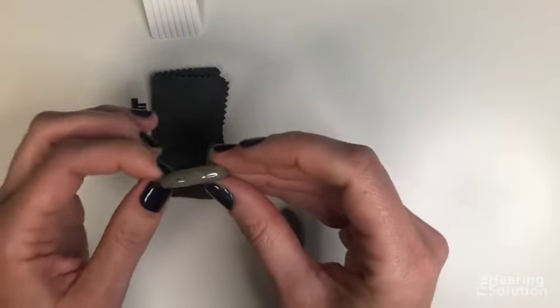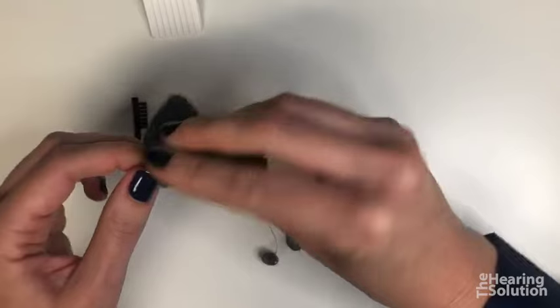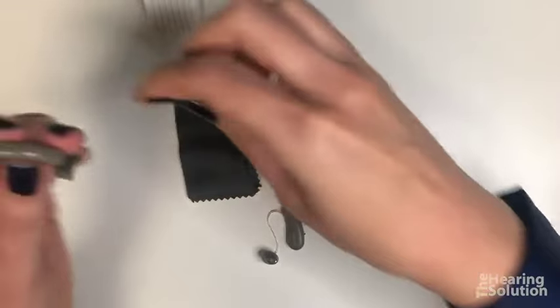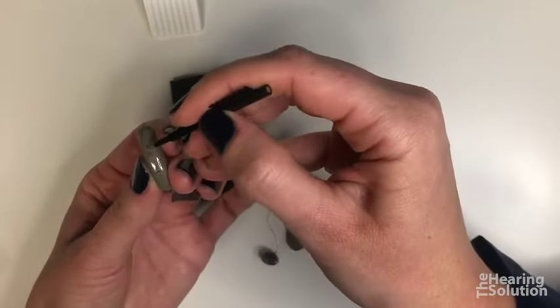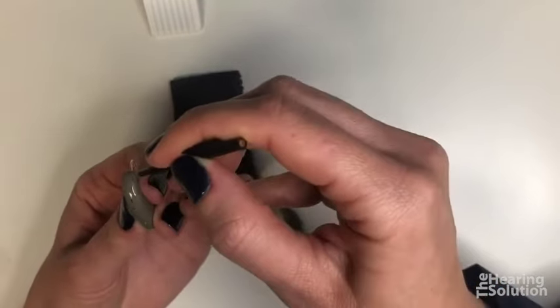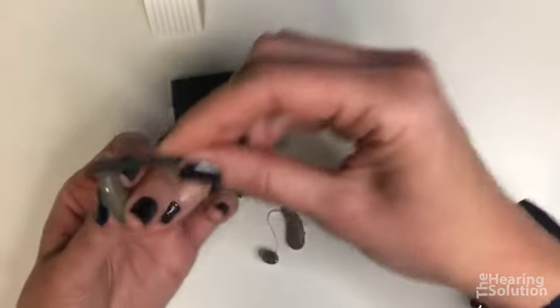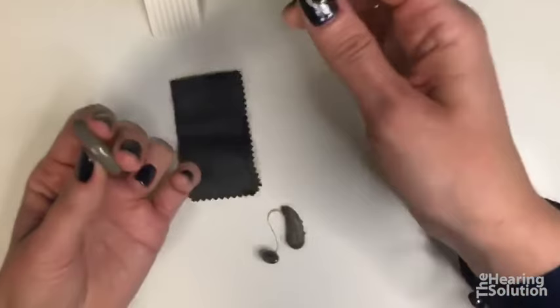To clean the back part of the hearing aid, you can use the dry cloth to just wipe down the back part. Then you can take your brush and brush the microphones. So your microphones are these tiny little holes. There are two in the front and one in the back. And you just kind of want to brush all of this. You can't be too rough with it, so don't be afraid, you won't hurt it.